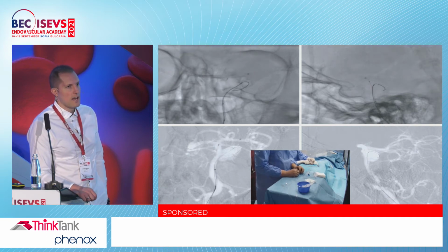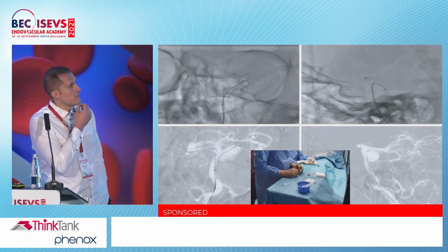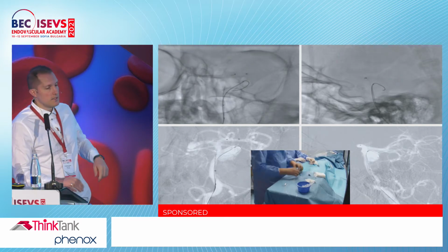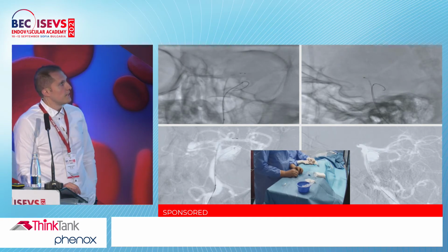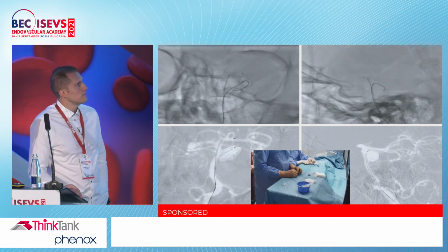As you see, we just half unsheath some portion of the stent, so the first microcatheter is protected from traumatizing inside the aneurysm if there is any intrusion between the two microcatheters. So here is the tip. You can see it on the non-subtracted images above. Here is the tip of the stent. The stent is still inside the microcatheter.